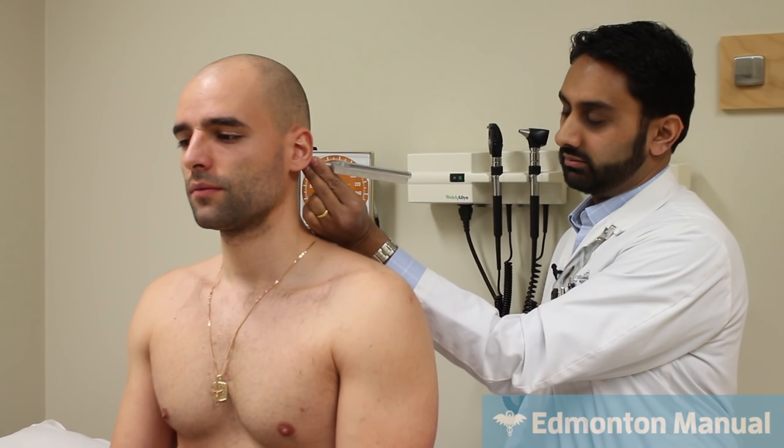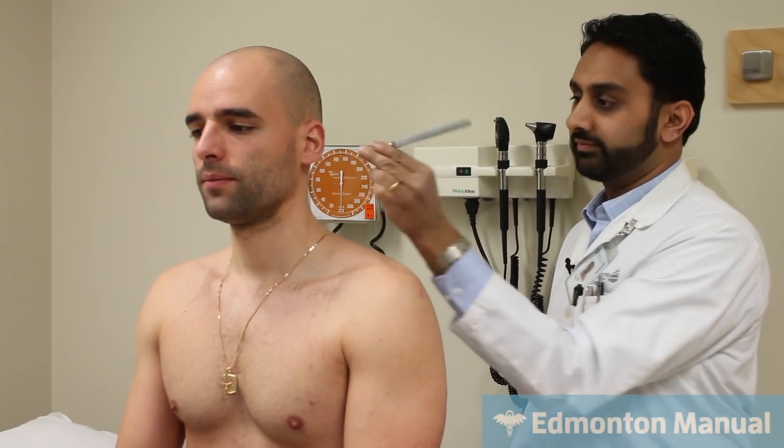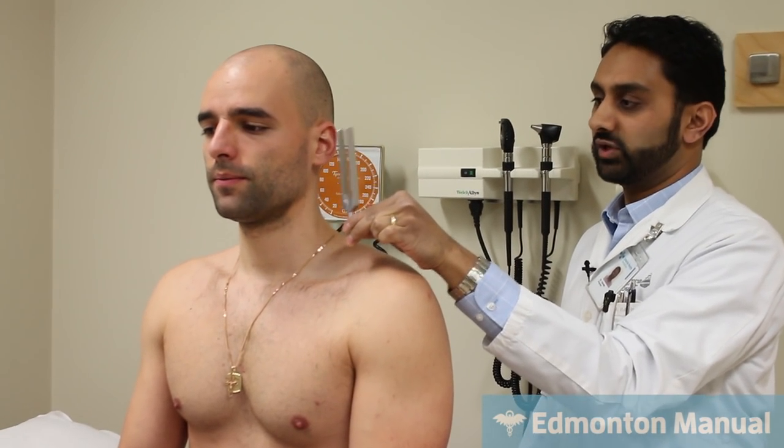Now. Can you still hear it? Yes. Okay. And that is a normal finding in the Rinne's test. Now, what you have to realize is you can get that quote-unquote normal finding on an ear that subjectively has problems. And what that suggests is a sensory neural problem, meaning the relative air conduction, bone conduction is still preserved, but everything is decreased.